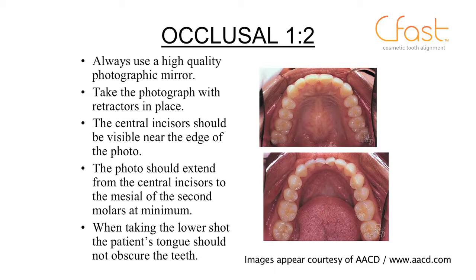When we're taking the lower shot, we want to have the tongue below the occlusal surfaces, so we're not obscuring the occlusal surfaces of the teeth.